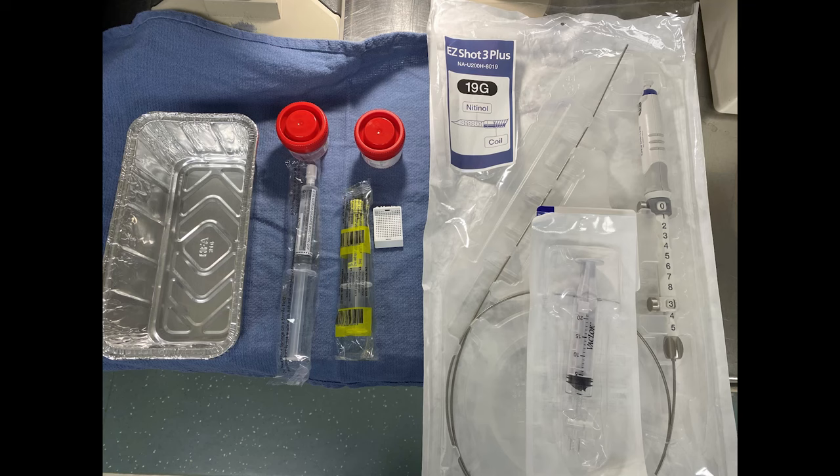The prep for it involves the EUS FNB needle along with the heplock syringe, a sterile saline flush, two surgical pathology cups, and a tissue sieve.